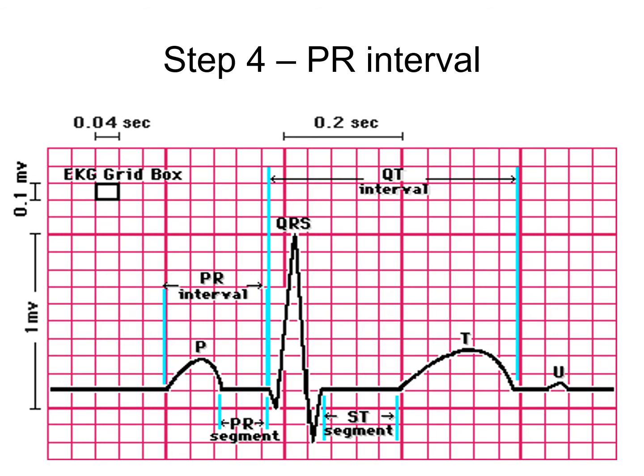You also could have a fat P wave with lung disease, okay? Not necessarily though a change in your P to R interval. So we're just looking to see if they're consistent and if the P to R is between 0.12 and 0.2 seconds.